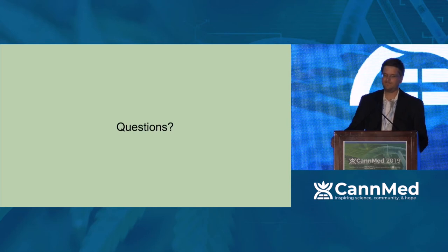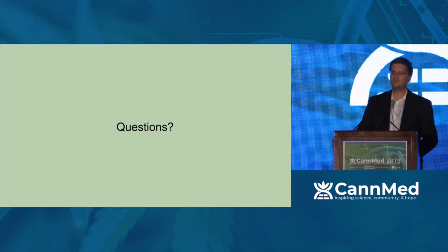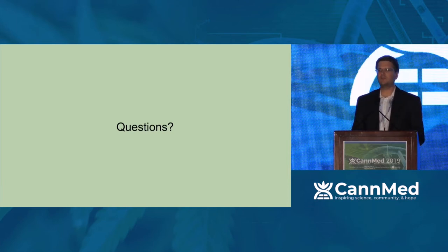Thank you. Well, can you comment on the addition of beneficial symbionts at any of the stages, mycorrhizae, fungi, those kind of microbial additions? Yeah, sure. I've worked in a bacteria culture lab, and when I did that, we had to make specific media and antibiotics so other bacteria didn't grow in there. When you're making tissue culture media, there's no antibiotics. You're basically creating a cocktail that everything loves to grow in, including fungus and bacteria. So you're perpetuating the problem if you add those inoculants right before you take the culture itself.